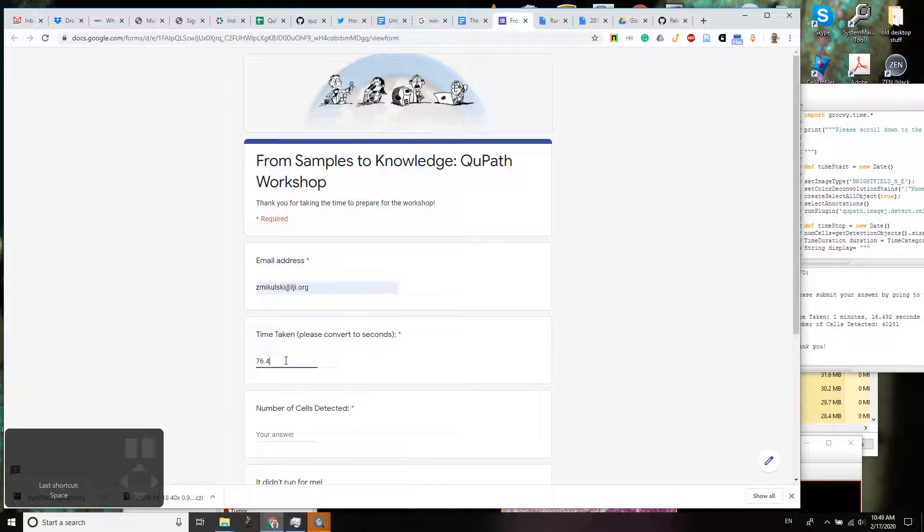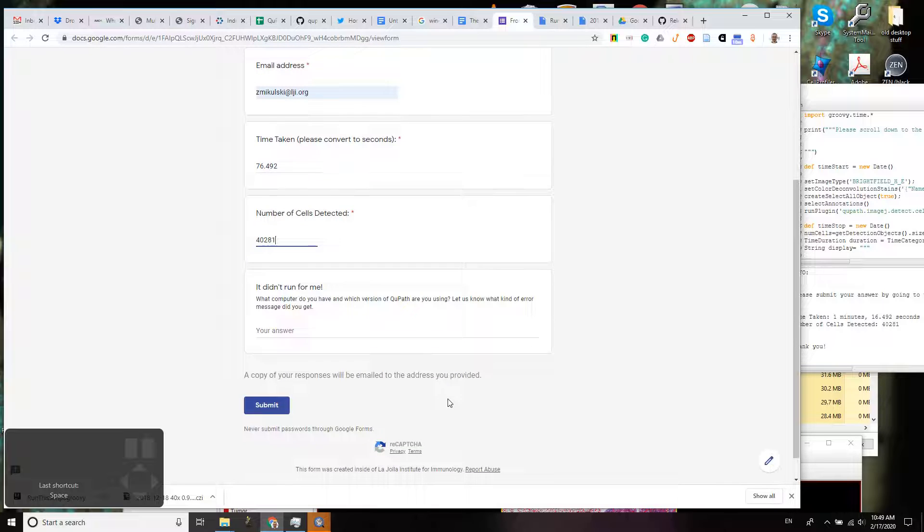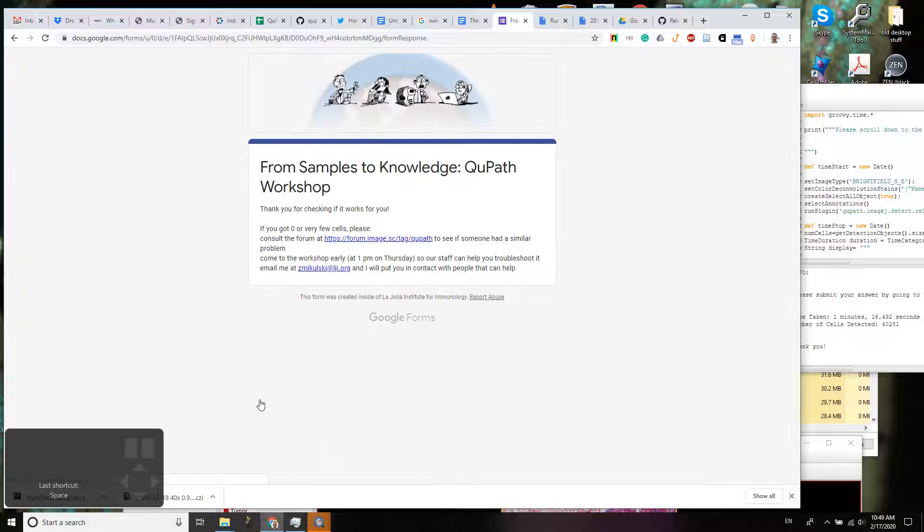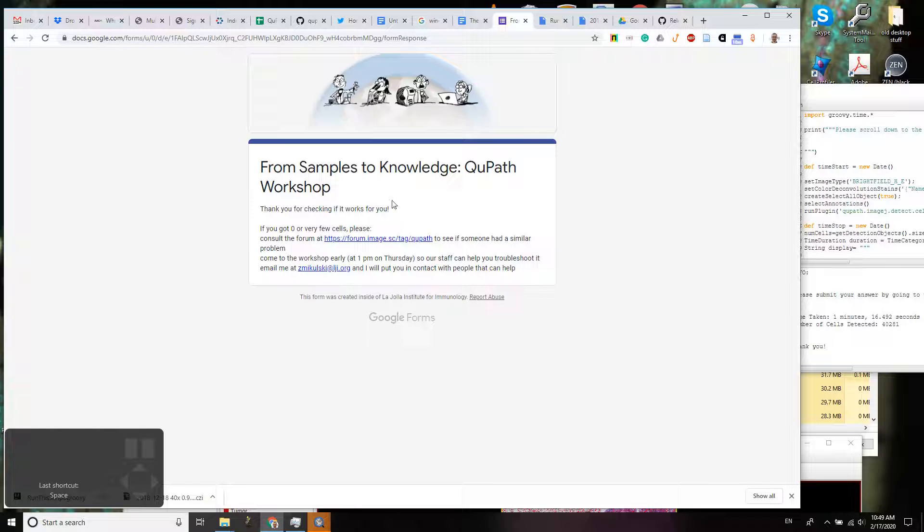76.1492 and we have 40,281 cells. Okay, and we are good to go.